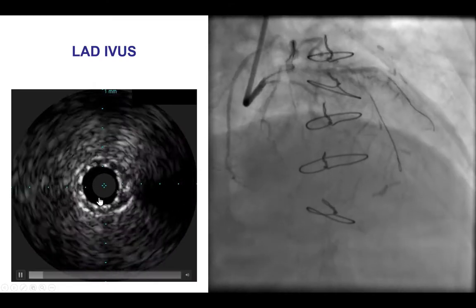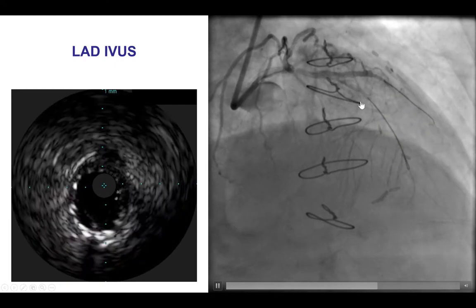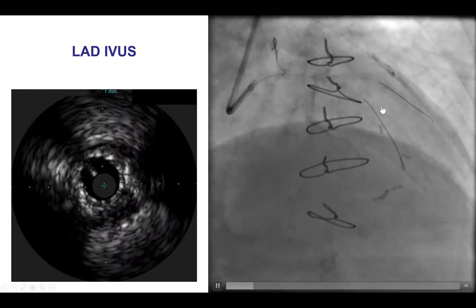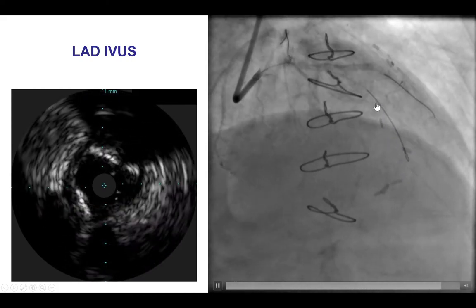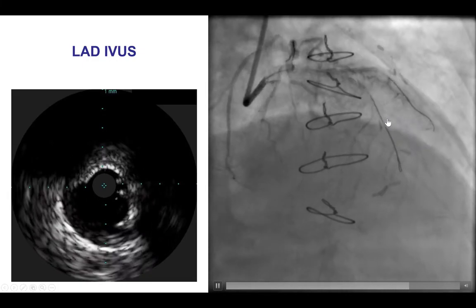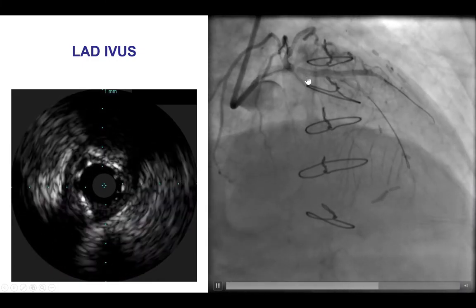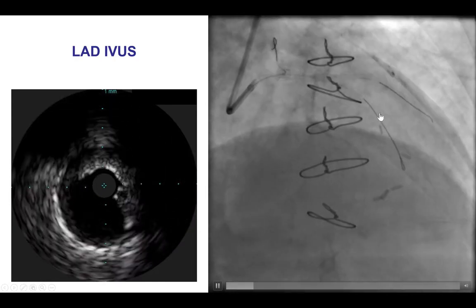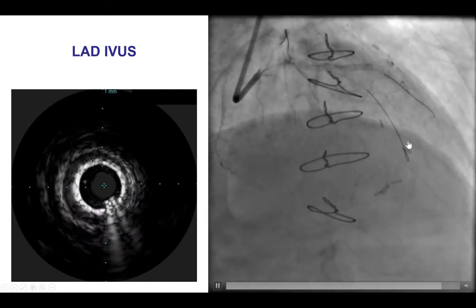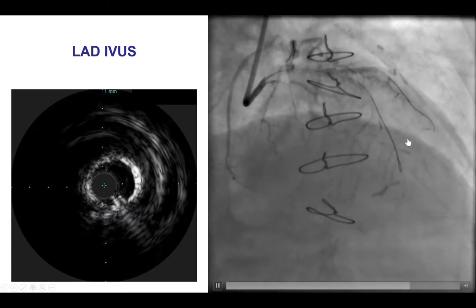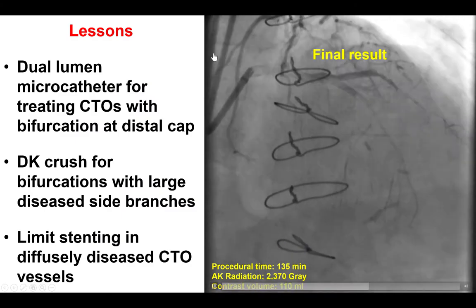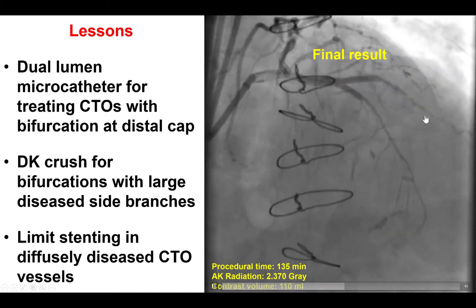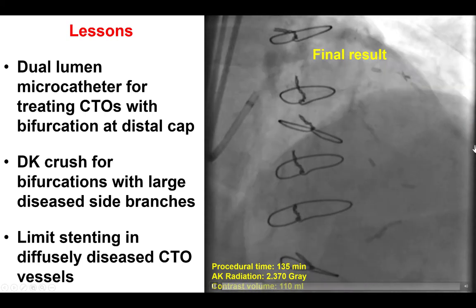That provided a nice result as confirmed by intravascular ultrasound. We did have diffuse disease in the distal vessel, which is not uncommon when a vessel has been occluded for a long period of time. In those cases, the vessel usually grows within a few months after re-canalization. It is best to limit the stent length, since placing longer stents carries additional risk for distal edge dissection and higher restenosis rates. A nice final result was achieved with TIMI-3 flow in both the diagonal and the LAD. There is some diffuse disease which we elected not to treat at this time.